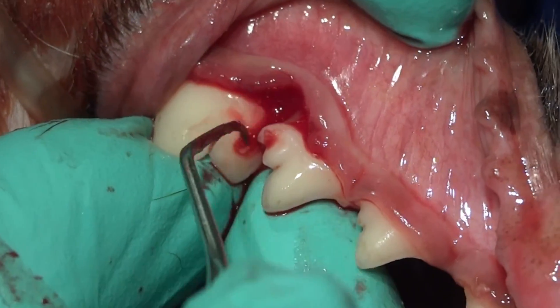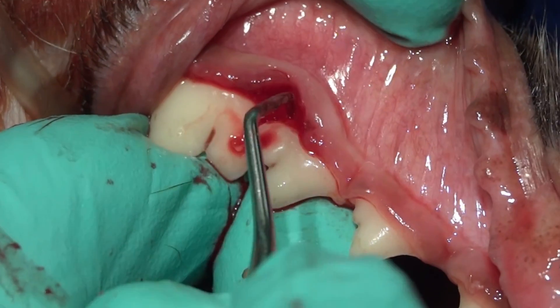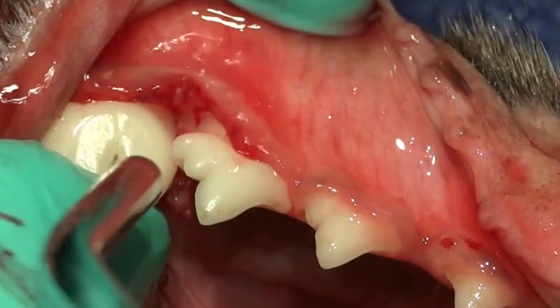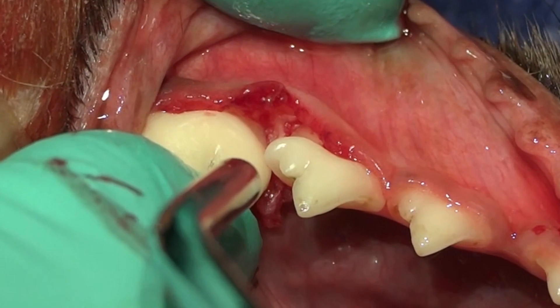Once we're done cleaning, what we want to do is confirm that those are actually clean defects, looking at nice bone by using our air water syringe and getting down in there to confirm that those are indeed cleaned. And as you can see, they are.